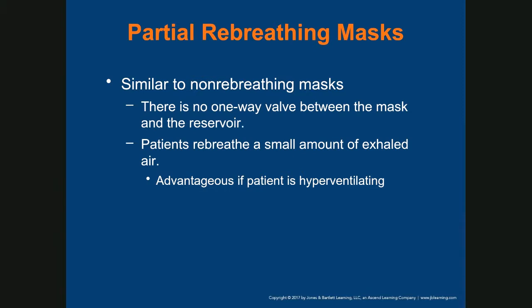And regardless of the use of the partial rebreather, if a patient is having a panic attack or hyperventilation syndrome, you have to calm them down before you put the mask on their face, right? So don't just put the mask on their face and say, breathe, man, breathe, right? You're going to have to have a conversation, right? Hello, sir, ma'am, listen, you're breathing too fast, right? You're going to have to control your breathing.